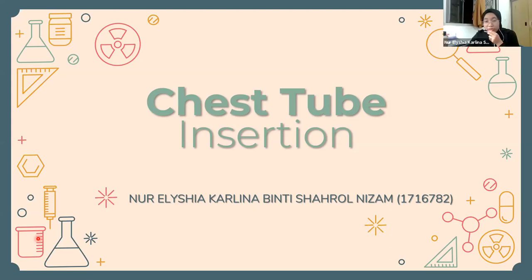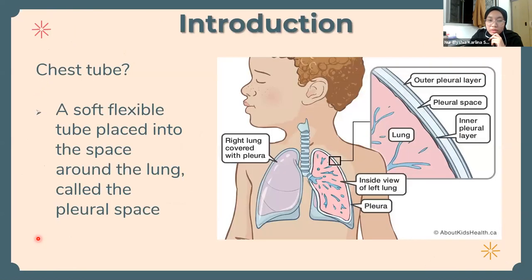Okay, bismillahirrahmanirrahim. Next I'll be talking about chest tube insertion, also known as a chest drain. So for the introduction, what is a chest tube? Basically, it is a flexible soft tube which is placed in the pleural space in between the visceral and the parietal pleura, where the main goal of the chest drain is to drain the fluid or blood or air in the pleural space in order to allow the expansion of the lung and to restore the negative pressure in the thoracic cavity.